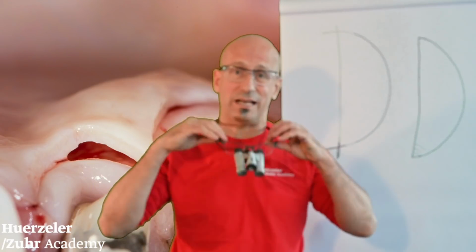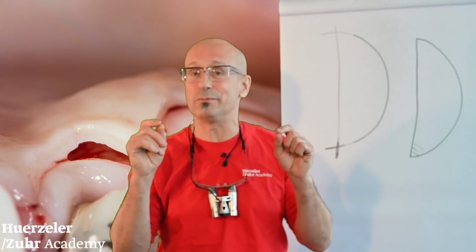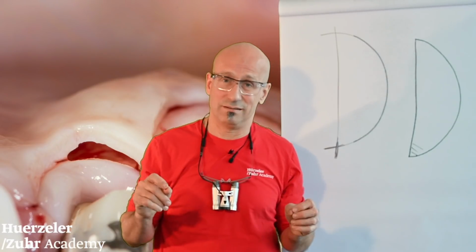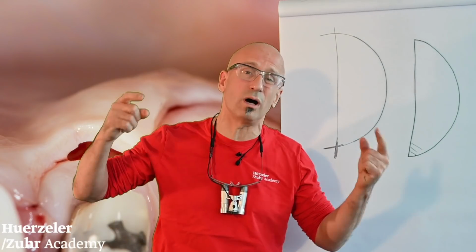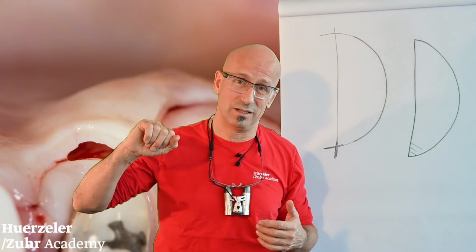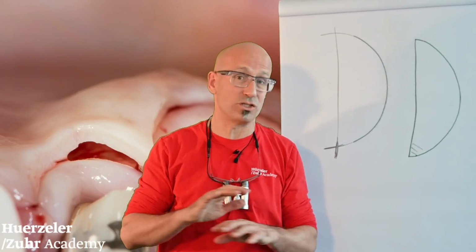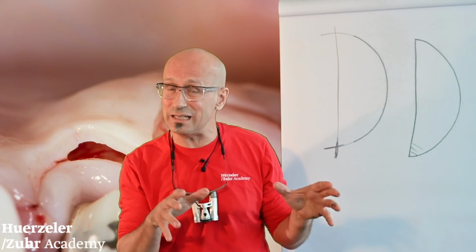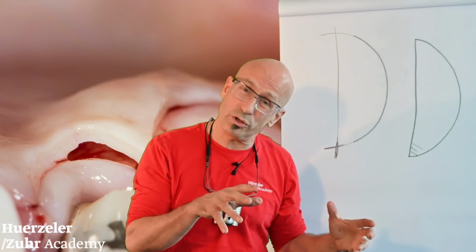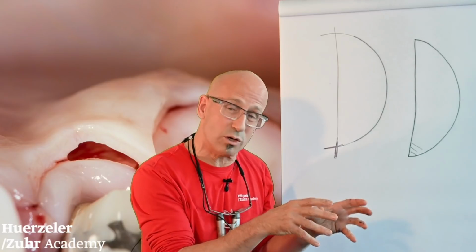And that's the reason why we developed these loops today. In this situation, we are more flexible, and don't forget, speed, time is always an issue for healing. So if it takes you too long to perform the surgery, you cannot expect the perfect result. So time is always an issue when it comes to surgery. There's no discussion about that. There is a lot of evidence about this issue. So you have to really decide yourself, and I can see a tendency in our clinic to use the microscope more, exactly because we can concentrate today more and more just on one interproximal area.